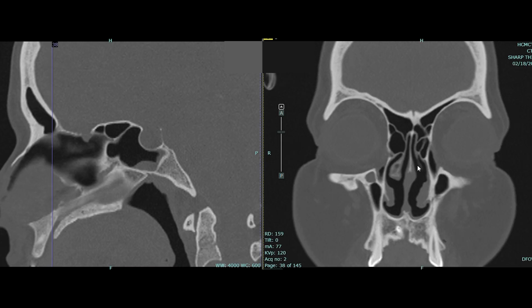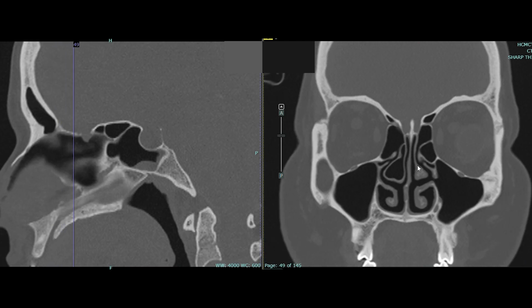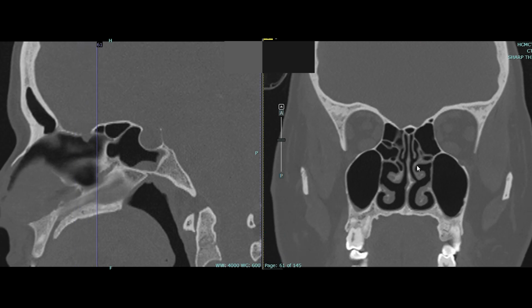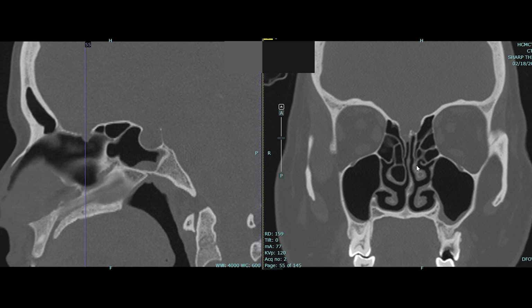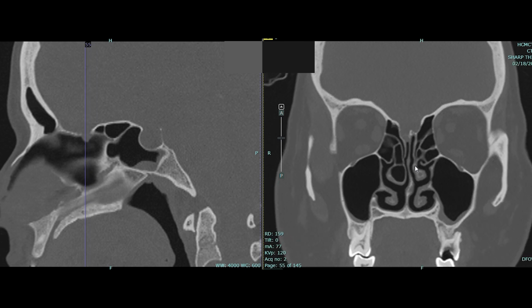This is the CT scan in both the coronal and the sagittal sections demonstrating a right-sided skull-base defect at the level of cribriform plate. As you can see, we navigate in the sagittal sections and the coronal section. We are able to see a small sac-like protrusion and a defect in the central anterior skull base at roughly the junction of anterior and posterior ethmoids.